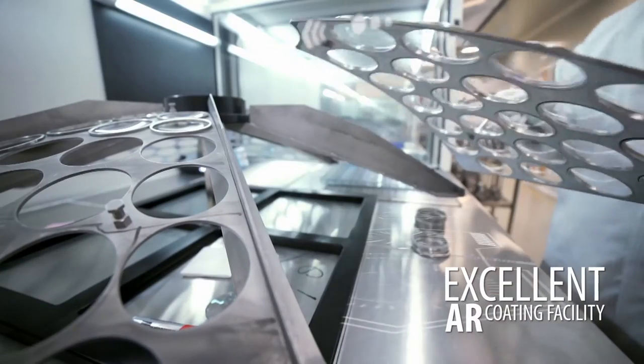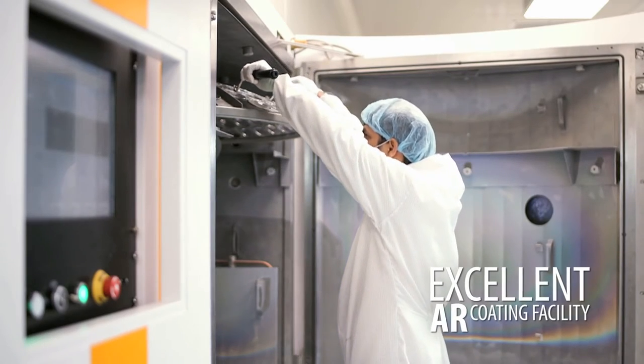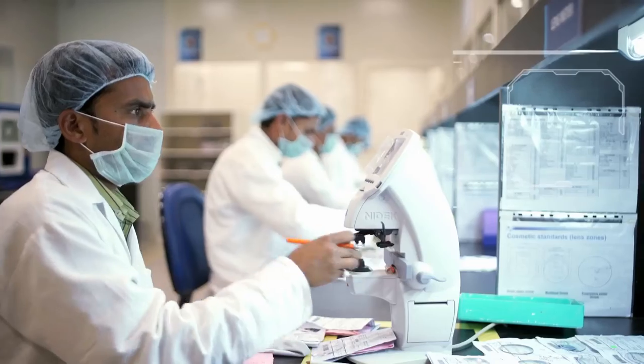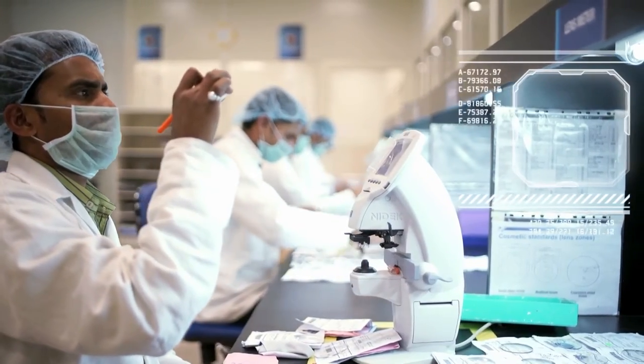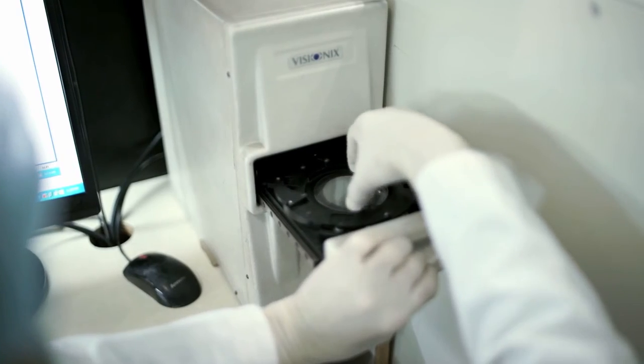Followed by assortment for anti-reflection coating in advanced machinery under sterile and controlled atmosphere. Following anti-reflection coating, the lenses undergo final quality check. Vision RX Lab exercises tight quality control at each step.